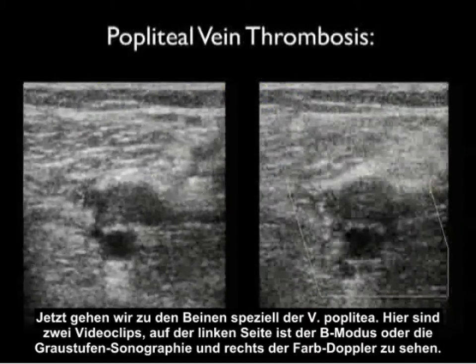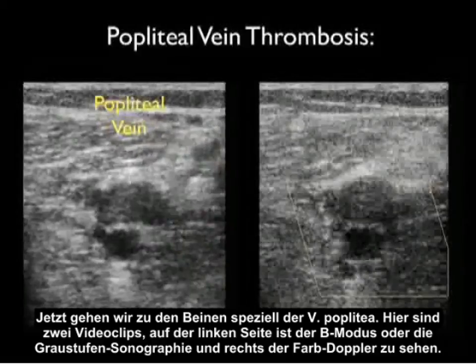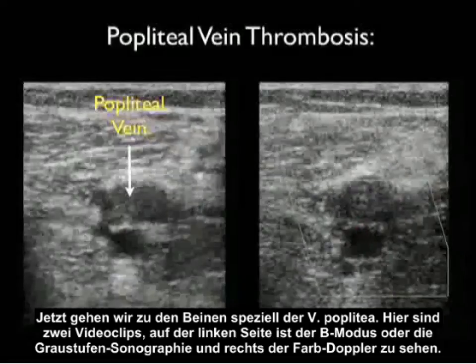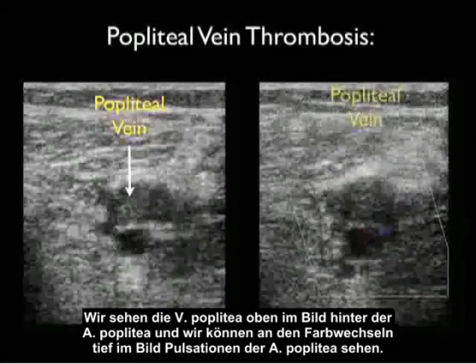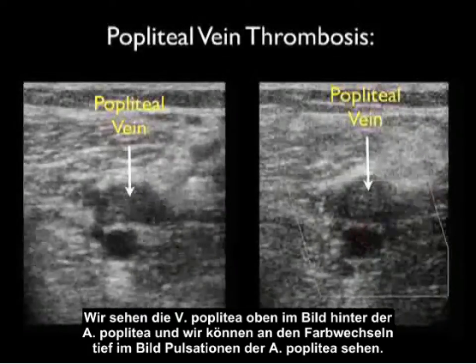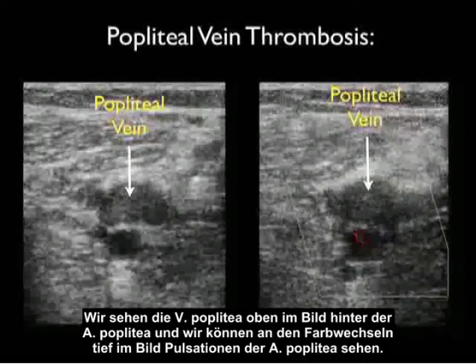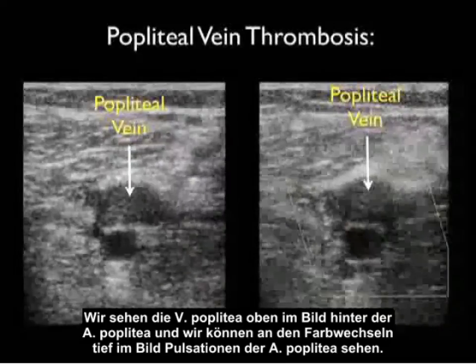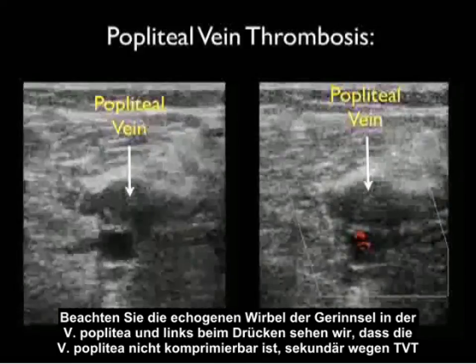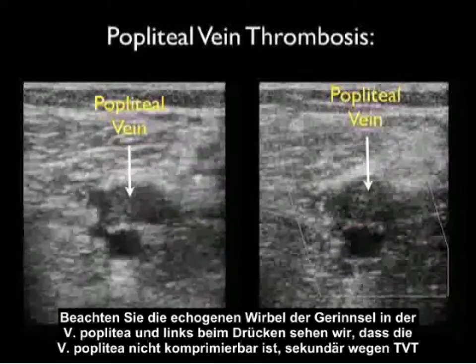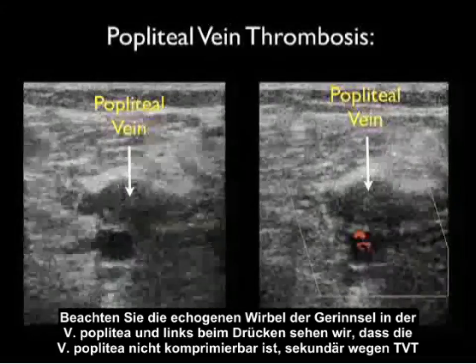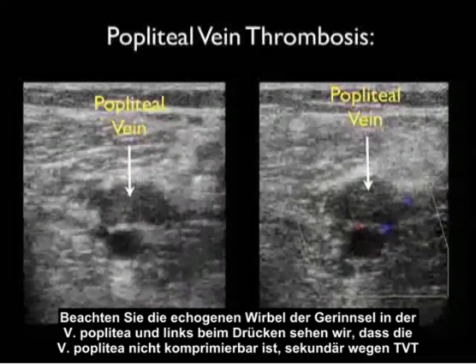Now let's move down the leg and look specifically at the popliteal vein. Here are two video clips — towards the left, a B-mode or grayscale sonography image, and towards the right, color flow Doppler. We identify the popliteal vein towards the top of the image, effectively posterior to the popliteal artery, and we can identify the color flow flashes and pulsations of the popliteal artery seen deep in the image. Notice the echogenic swirls of clot within the popliteal vein, and compressing down, we note the popliteal vein fails to compress secondary to the DVT.